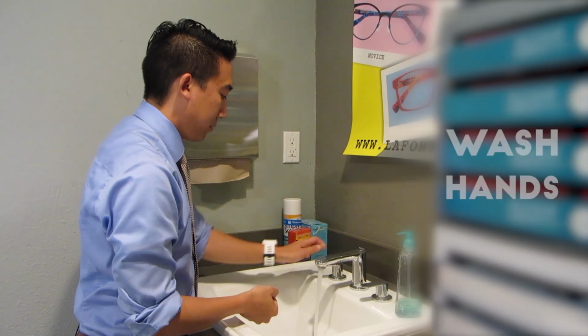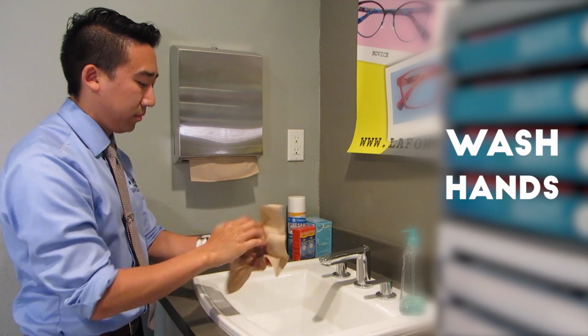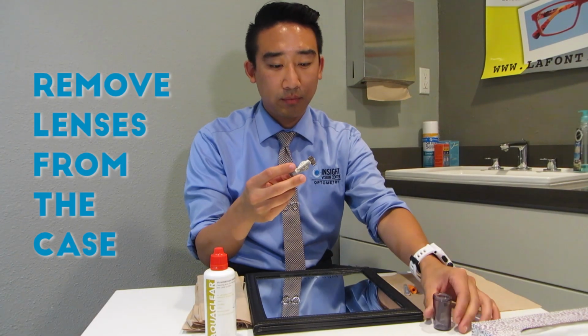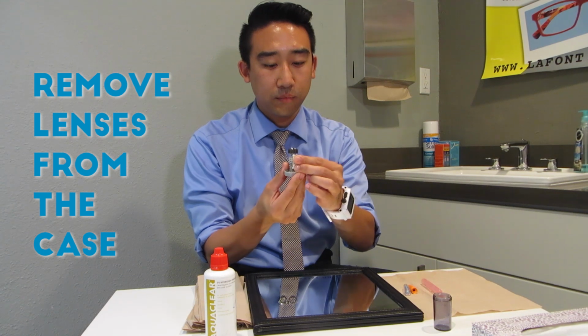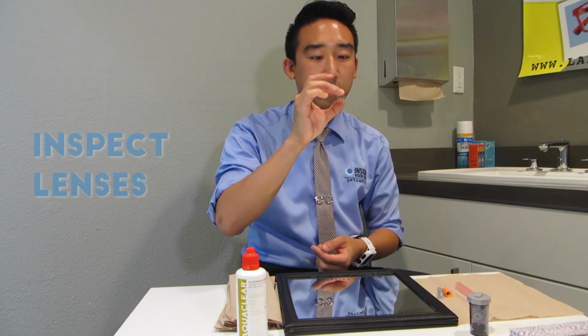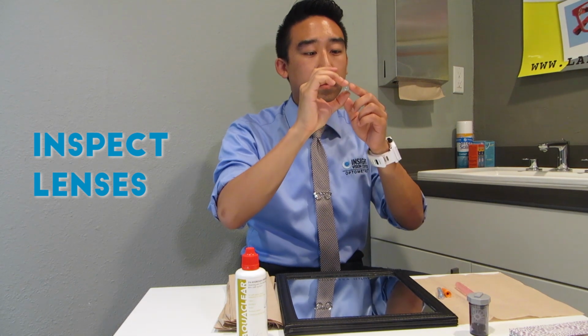Step 1. Wash your hands with lotion-free soap and a lint-free towel. Step 2. Remove your right lens from the case. Double check to make sure you know which lens is right and which lens is the left. Step 3. Inspect the lenses for chips or cracks.